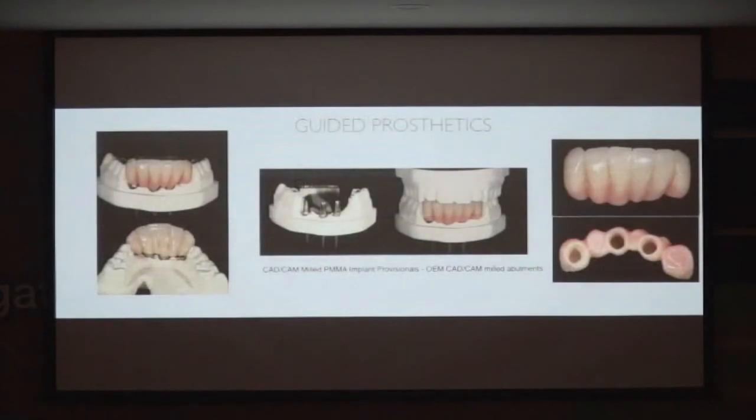And if we look at the prosthetics, you can see this is going to be easy to restore. Okay? That's what we want. And that kind of accuracy in thin ridges like that is critical. You can't do this freehand unless you make big flaps. And do you want to lay a big flap on a particulate graft like that? You don't, because you're going to lose more of it.